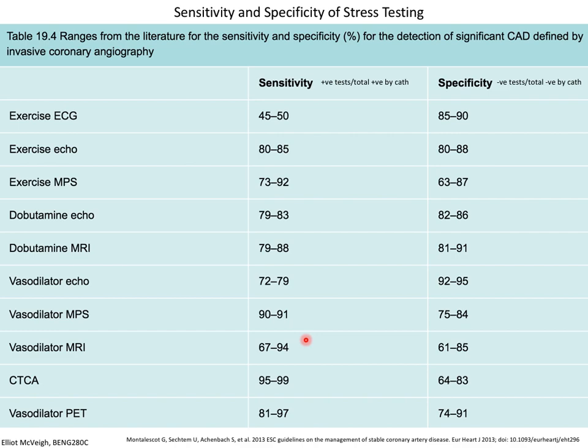Like, does it give me a boost in sensitivity over and above what I already have with that data? And then for physics people, that focuses your attention on what aspect of that imaging test should I improve? Like in terms of these patients, which is the aspect of the imaging that I should improve? Should I make it widely available and cheap? Should I make it specific for a very specialized group and not care about the expense, et cetera, et cetera?